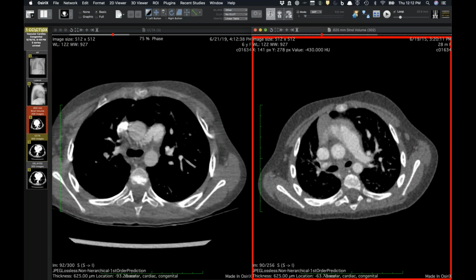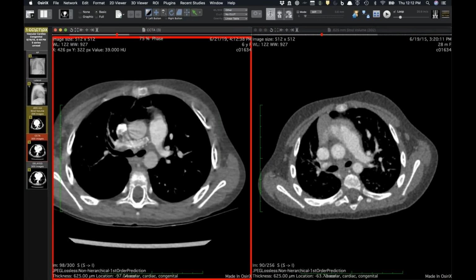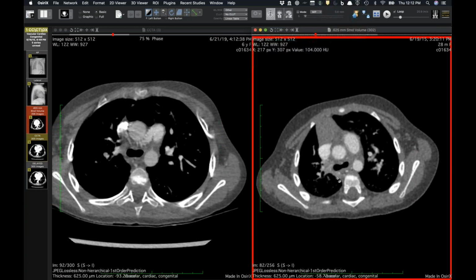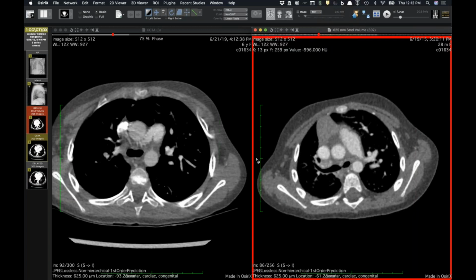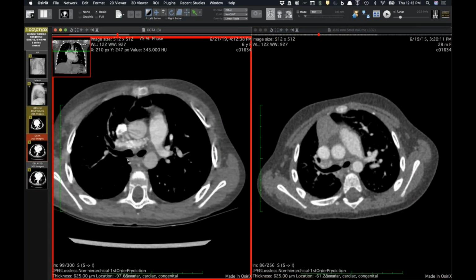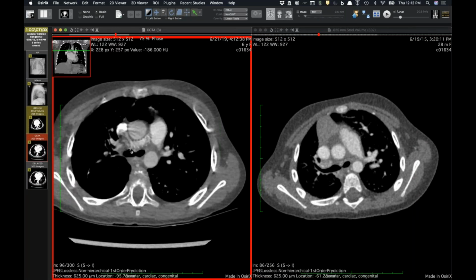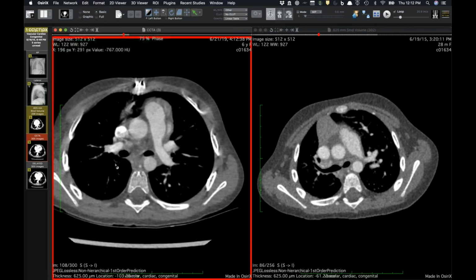Because, yeah, I just consider when you have a pulmonary vessel or a vein coming off an artery like that, I just refer to them as isolated. I think there's a paper somewhere out there talking about it. I can try to find it. I might be wrong, but at least in these, it's important not to say that it's just absence or agenesis of the pulmonary artery, because clearly that's not what it is. It's the regression of the portion of the sixth arch from the ductus, as they showed in this case, where they were able to reconstruct it because there's still peripheral pulmonary arteries.